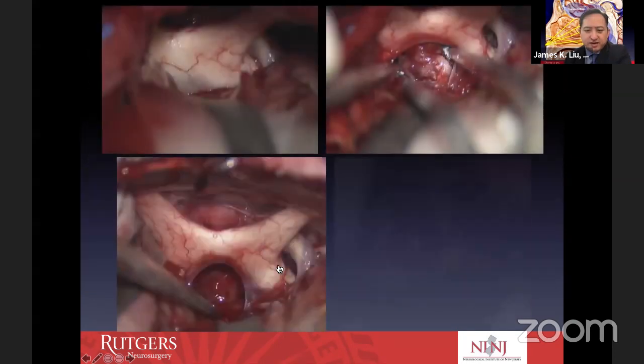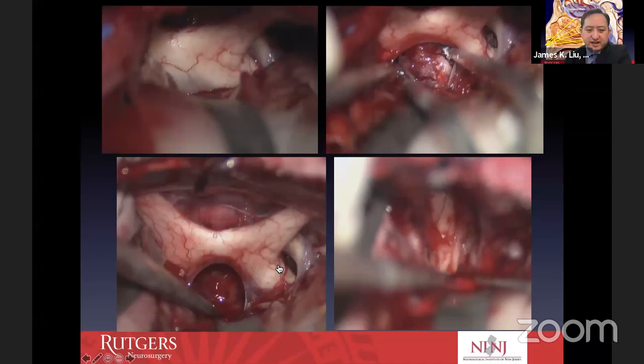And of course, we must remember that when you come from above, it looks great, but there will always be a blind spot underneath this area of the chiasm. Now you can try to use endoscopes transcranially or angled dental mirrors to look for this area, but it's very difficult to dissect this area because it is a blind spot.